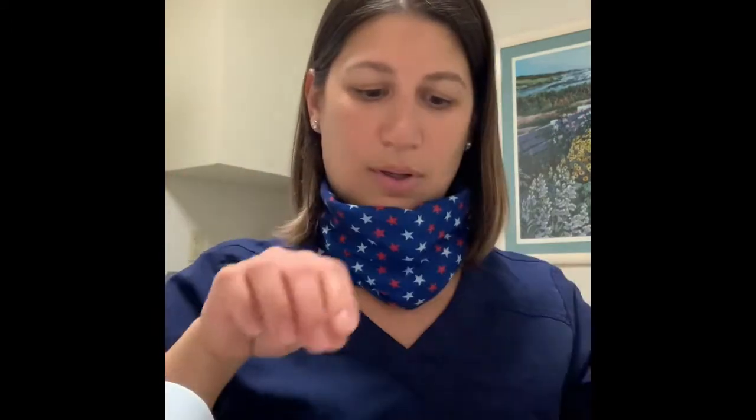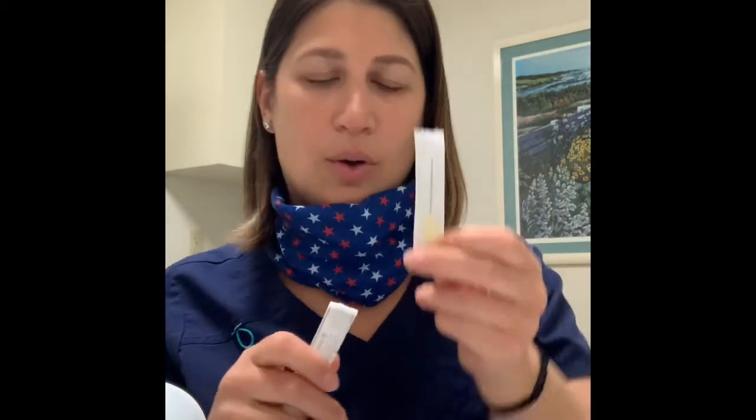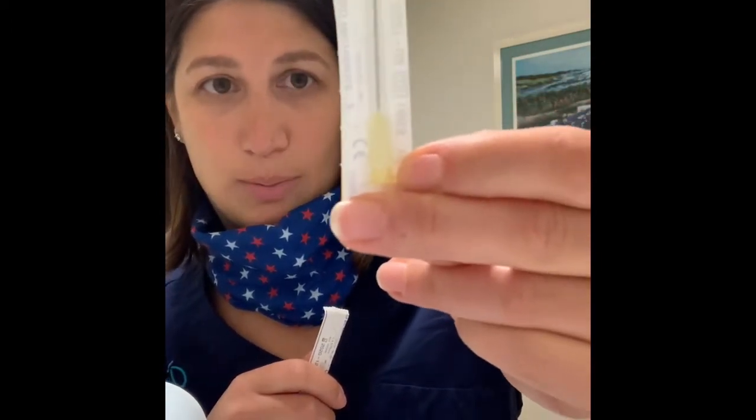This medication comes as a kit. You're going to peel this back. Inside will have some alcohol, a vial with powder which is the actual medicine, and a syringe that's capped with fluid already in it. On the side will be two needles. One will have a yellow hub — that one is just for mixing. As you can see it's really long; this one is not going into your body.